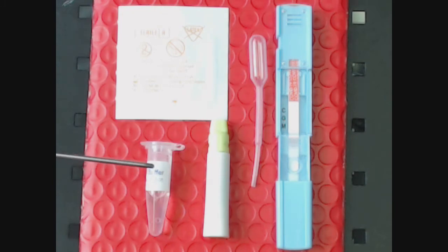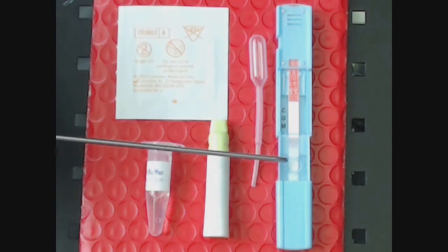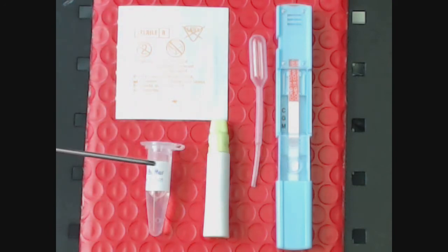This is your buffer fluid. You're going to be using the same pipette that you would draw the blood up to use the buffer. And of course, you're going to use your alcohol swab.